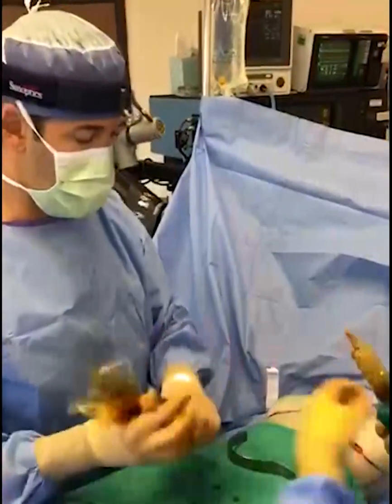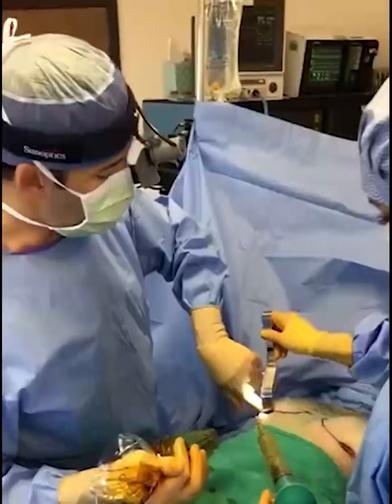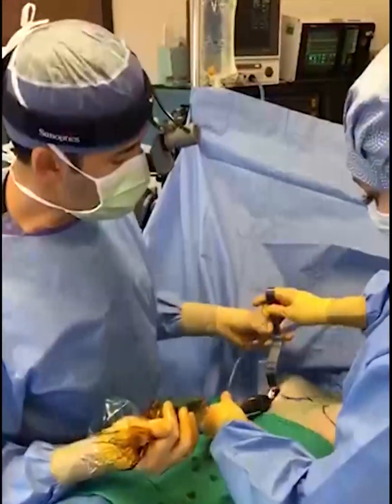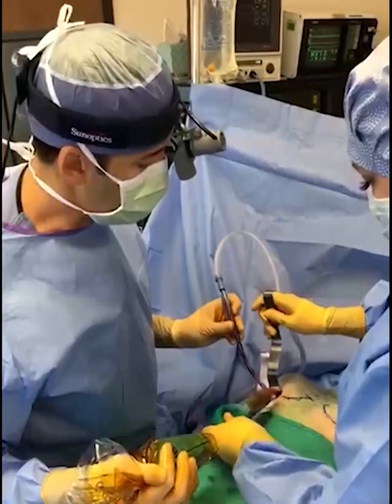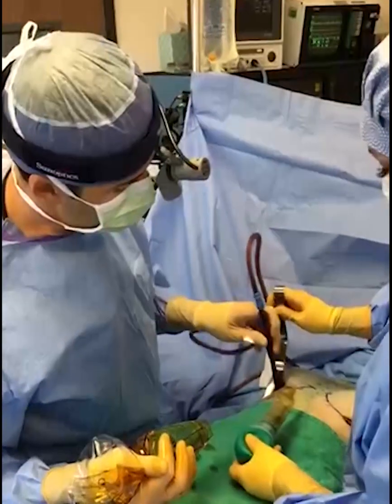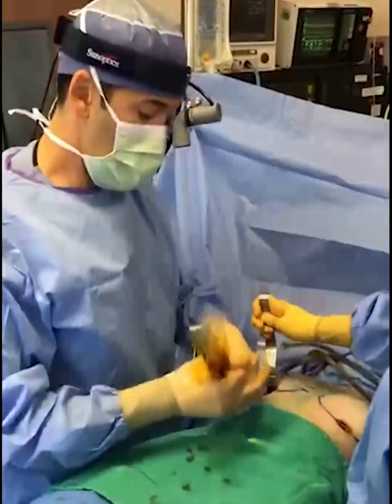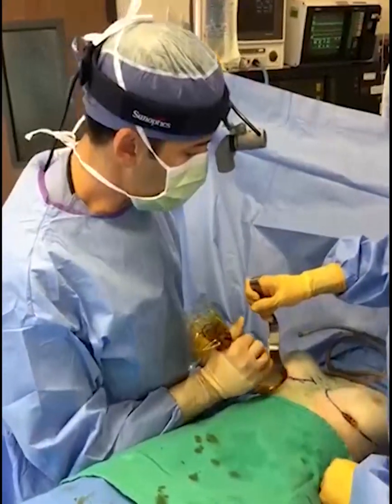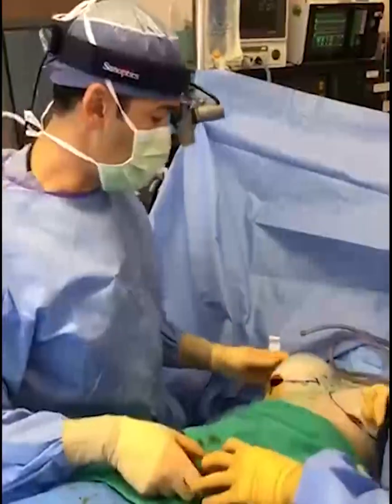And then what we're going to do here is we'll replace that retractor. And again, this is all behind the muscle. We're going to go ahead and irrigate the pocket with that same solution. We've already irrigated several times with just the antibiotic irrigation, but we'll do this one last time with the betadine and the antibiotic. And we're going to go ahead and insert that implant. It's as easy as that. Very simple.